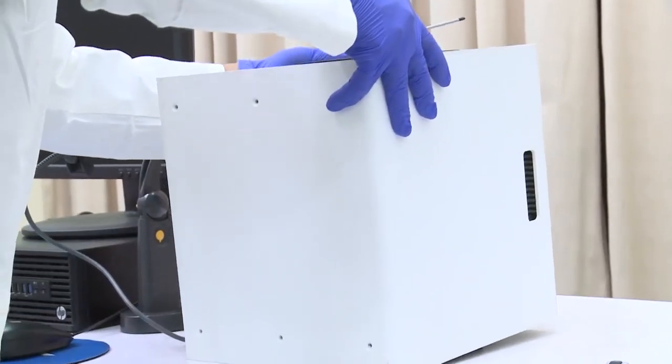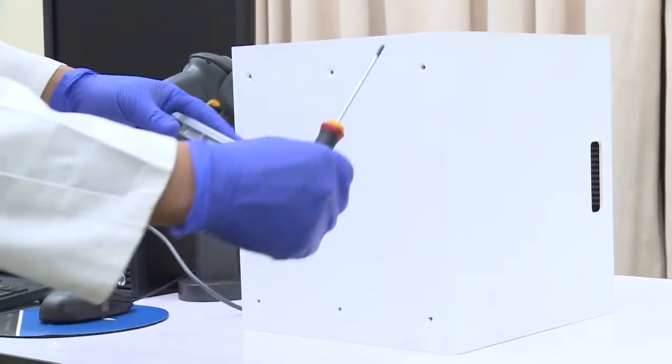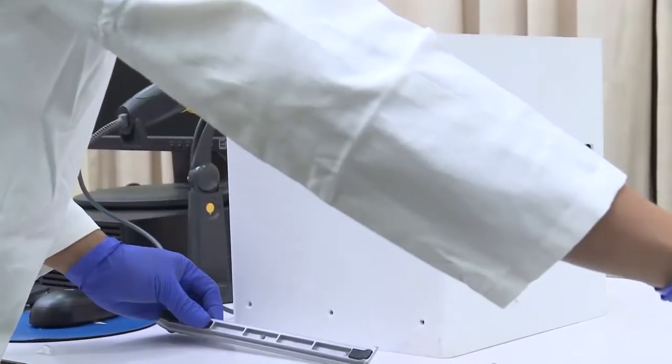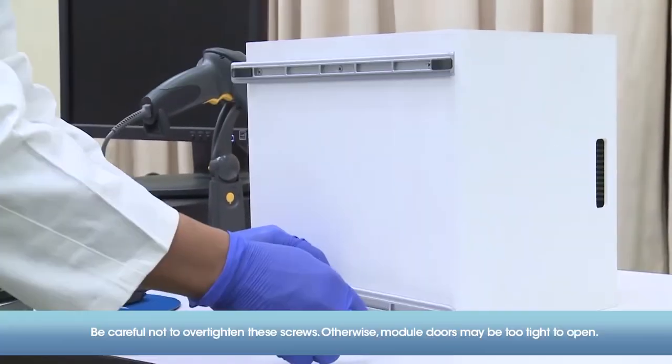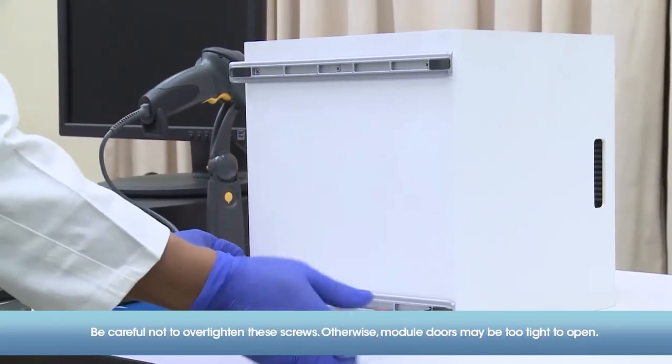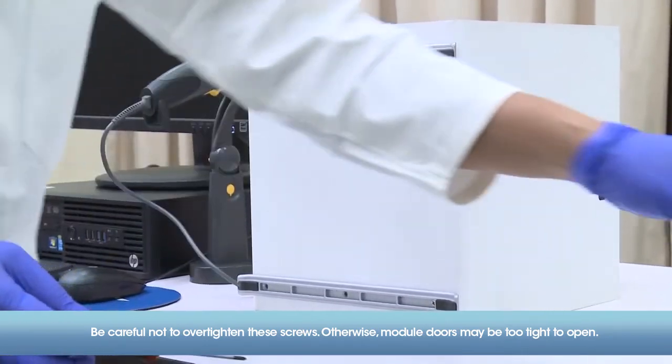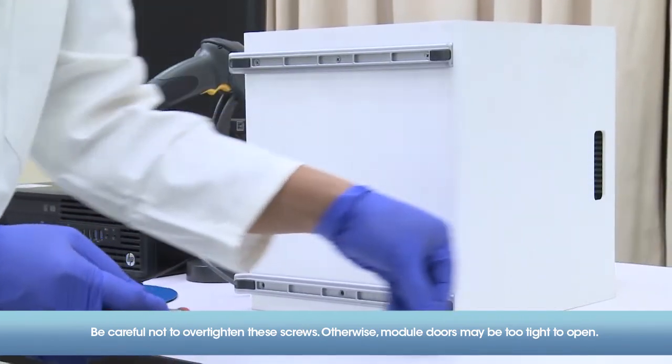Then place the machine on its front and put back the three screws on each foot. Be careful not to overtighten these screws, otherwise the module doors may be too tight to open or may not be opened.